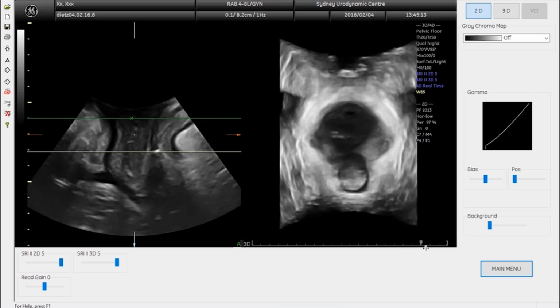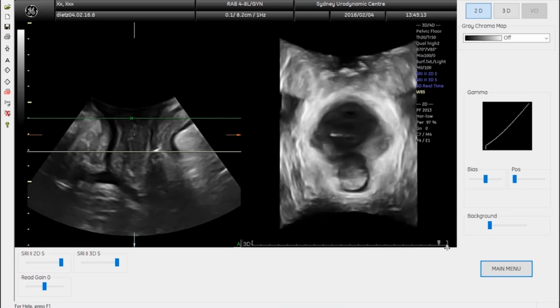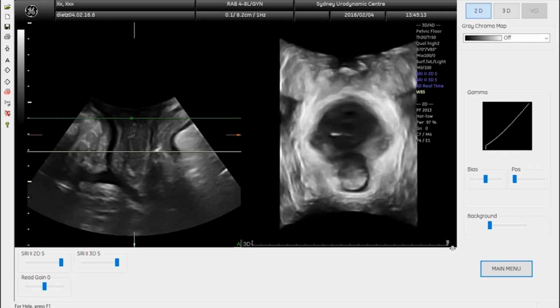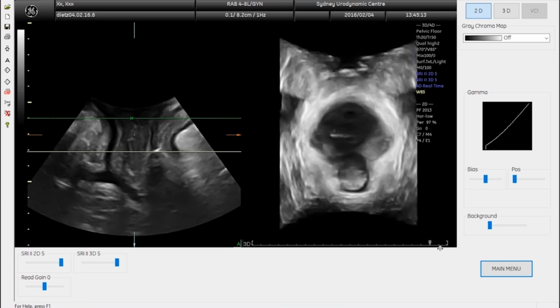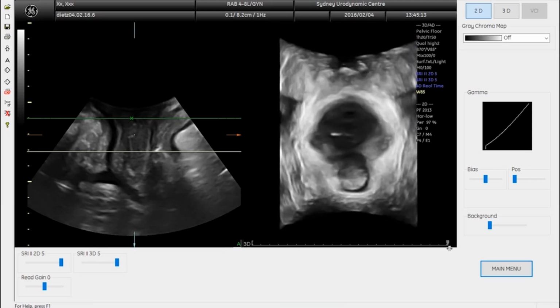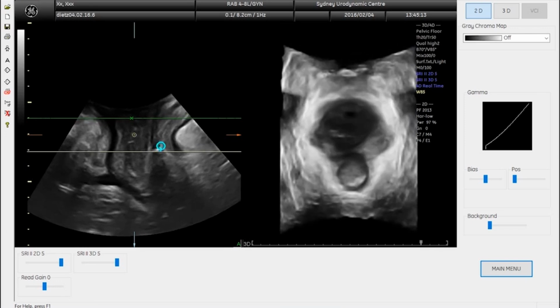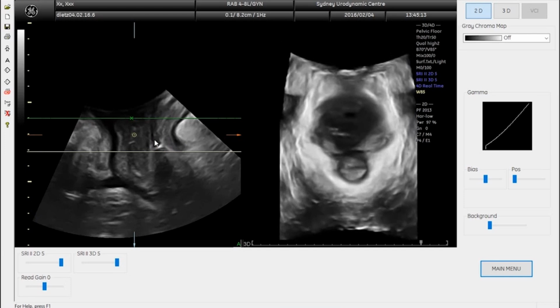But now something else is happening, and for those last few volumes here you can see that the bladder neck, all the pelvic organs actually move downwards a little. That implies she's co-activating. She's actually contracting her abdominals. Not that that makes any difference to the assessment of the levator. It's just something that you may consider talking to her about to reduce the likelihood of her doing a contraction that's confounded by contraction of the abdominal muscles.